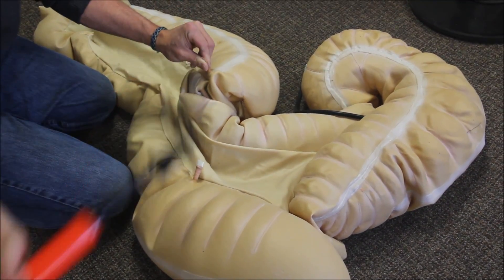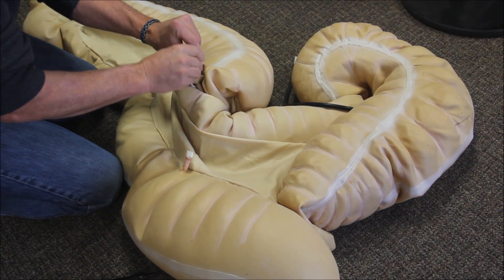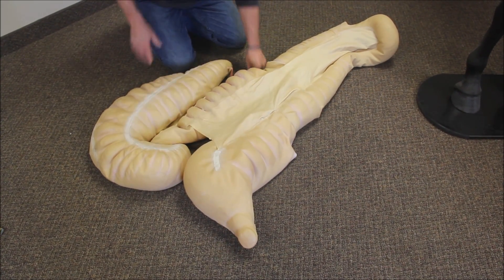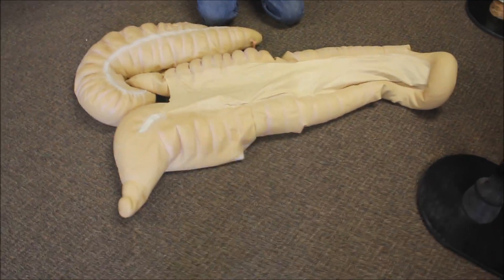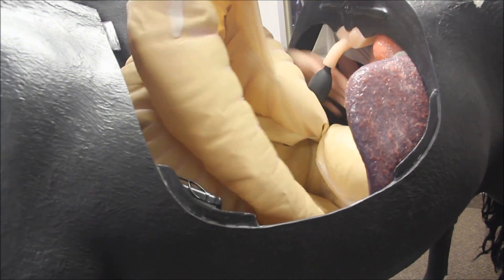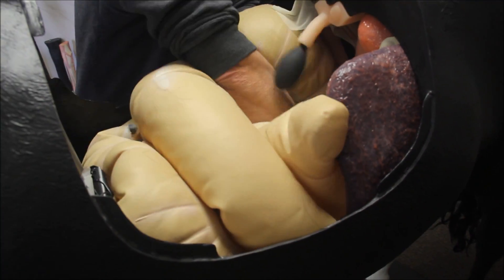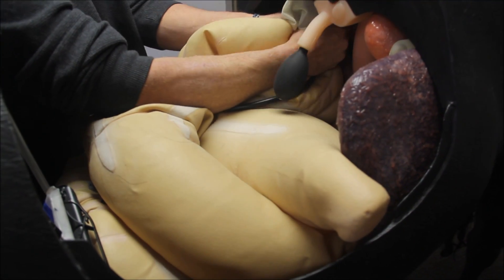The equine GI tract is an inflatable latex unit. Care must be taken not to over-inflate any of the five compartments. The transverse colon connects here. This is the cecum, and here is the pelvic flexure. To install it, fold the unit as shown and place it into the horse. The black tube connects to a D-ring located in the dorsal wall within the horse.